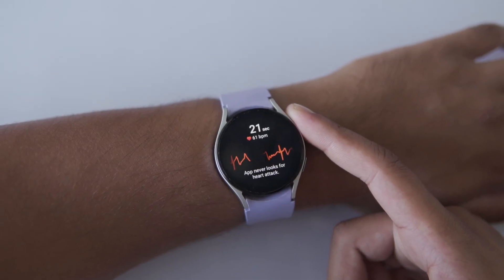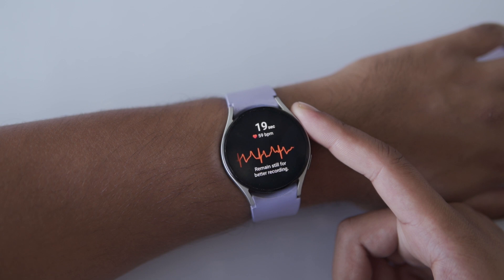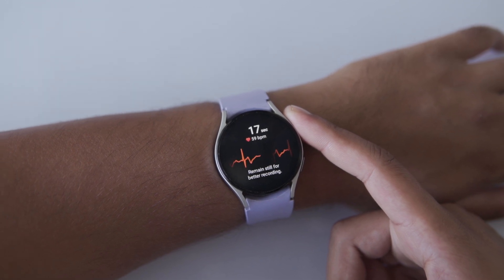Imagine having a personal heart monitor right on your wrist, giving you real-time insights into your health. I'm talking about the ECG feature on the Samsung Galaxy Watch. In today's video, I'll quickly show you how you can use the ECG feature on your Galaxy Watch.